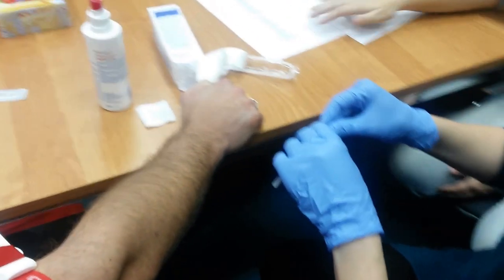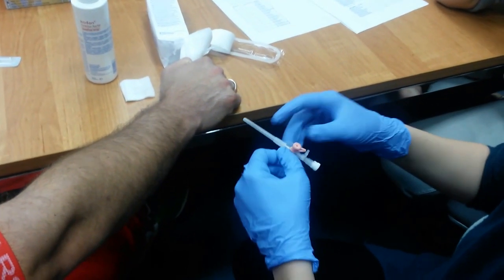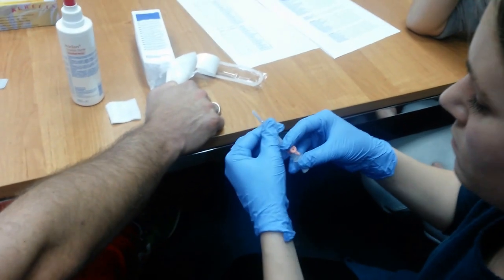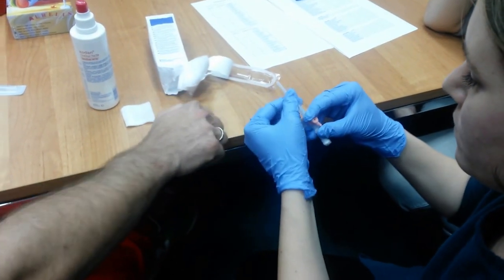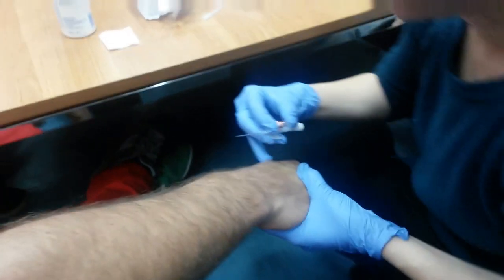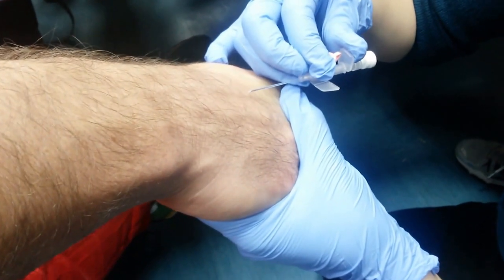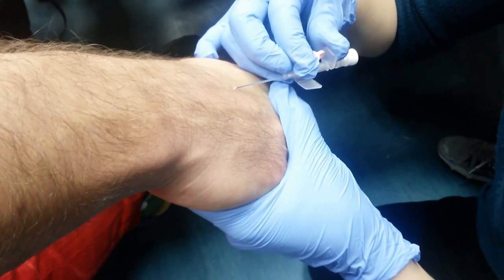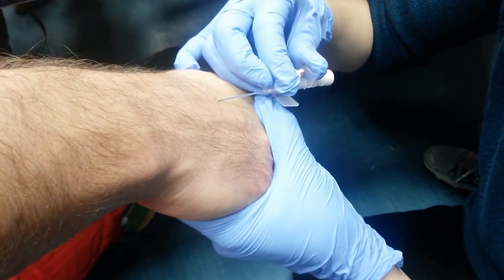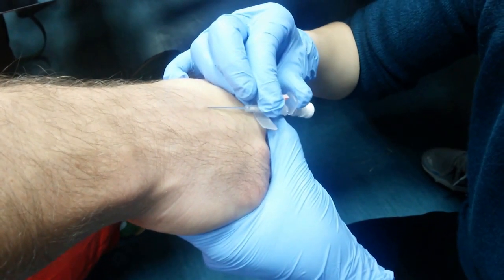Are you doing okay? — I don't even feel it. Now she's cleaned it, she's found the vein, and she's prepared it. She's getting ready for the insertion. You should also tell your patient what to expect — expect a small needle stick.